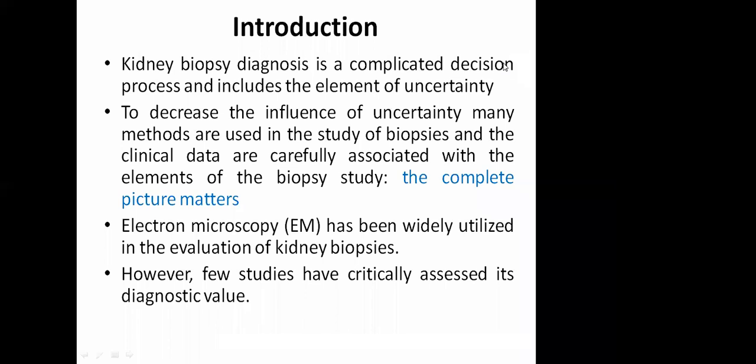What is the morphology? For example, if the patient has nephrotic syndrome and no renal dysfunction, serum creatinine is normal, so we know that we need to look at the glomerular compartment. The pathology lies in the glomeruli. And in the glomeruli, if you find a membrane thickening, the morphological light microscopy diagnosis will be membranous. Then you proceed with the immunofluorescence.